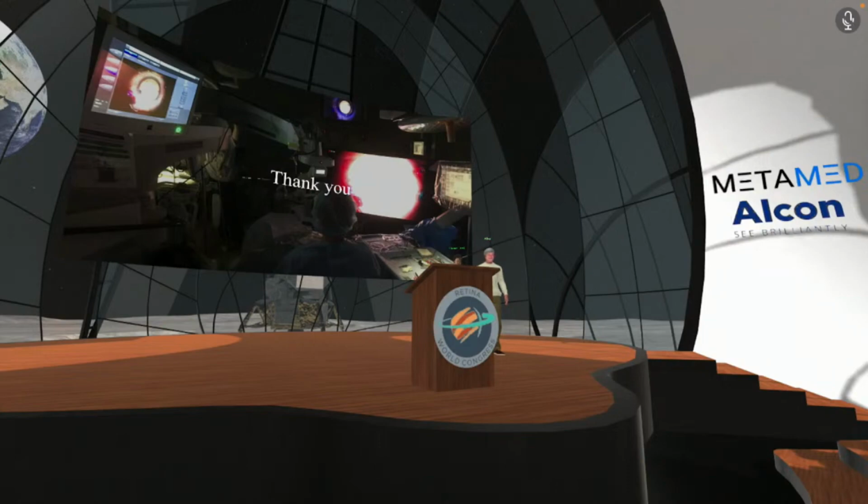Oh, I think I missed that when I popped out. My gain setting is 1. I never increase the gain because the image has a lot of noise. Yeah, it tends to get granular. Yeah.